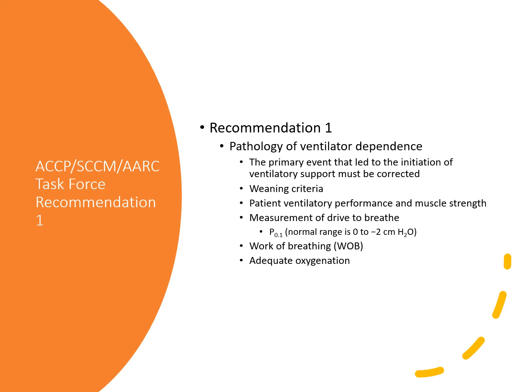The respiratory rate is easy to count, and it can be a fairly reliable guide to their ability to tolerate a workload. That's why we try to make sure that the respiratory rate is less than 35 in a wean. And if it is greater than 35, it usually indicates they're not ready to be weaned. They're still breathing too fast. They're still trying to compensate for some sort of disease process or something. So the pattern of breathing is also going to be valuable. All right. You should look at the patient's sedation as well. Maybe the sedation is altering their breathing patterns, or the injuries might be altering their breathing patterns.